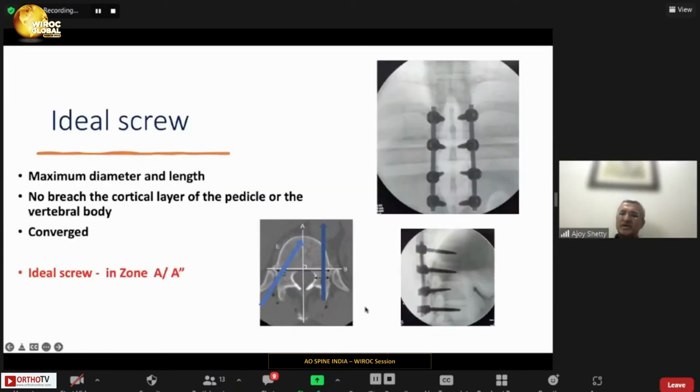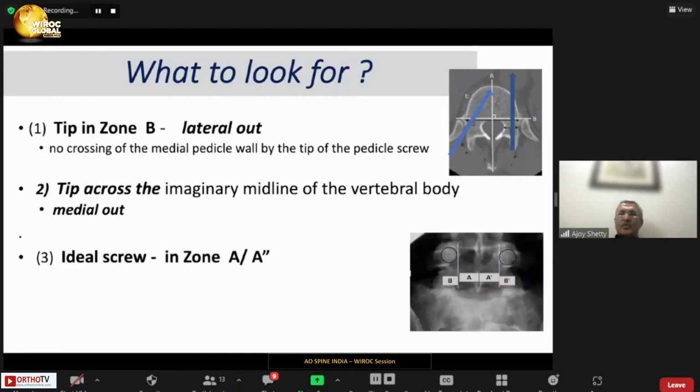It is also important not to have a screw coming almost to the anterior cortex, unless in certain specific situations. 75% could be adequate, as you are all aware that the vertebral body has a convex part and it varies from vertebra to vertebra. You see on the left and on the right, this is the same length, but on the right, if you are going straight ahead, the chance that you might enter or damage the aorta is significantly higher. Therefore, what to look for?